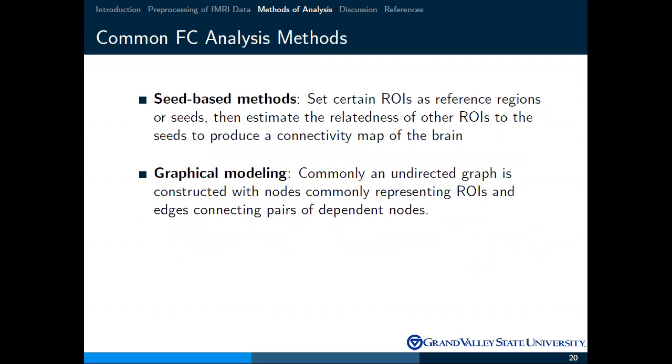And these then are used in two main areas within FC analysis. What are called seed-based methods, where you designate one brain region or voxel as a seed or reference region and look at the relationship.